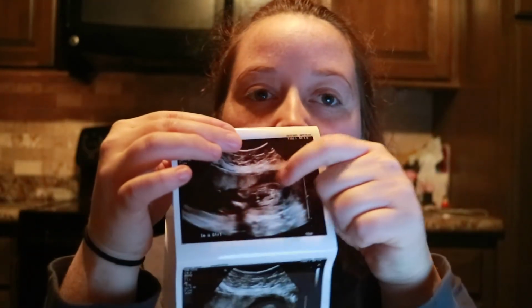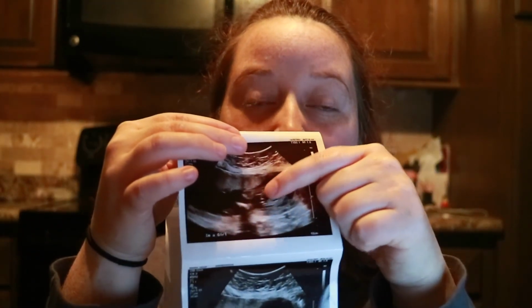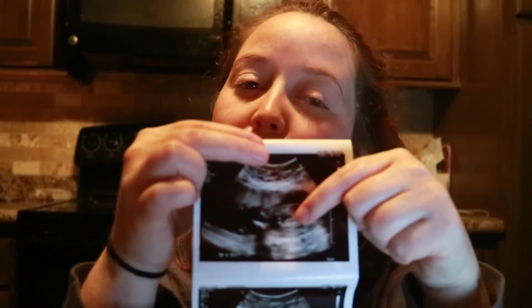And bam! It is in fact a girl. So this is kind of interesting, but basically you have her butt, and then you see there's a space between her legs, and if she was a boy, there would be a basically prominent penis there. I do remember with Jason's, there was a pretty prominent penis on his ultrasound, so she said we'd definitely at least see if she was a boy, there would be a bulge or something, but she says basically because there's no bulge at all, it is a girl. So that's kind of how you read these, and it makes sense.